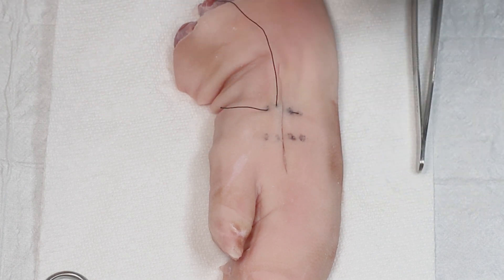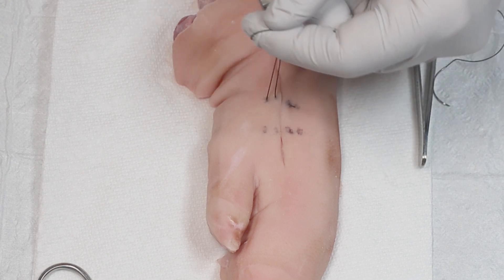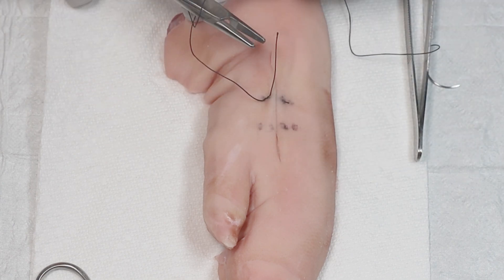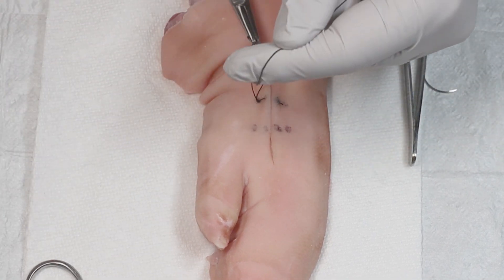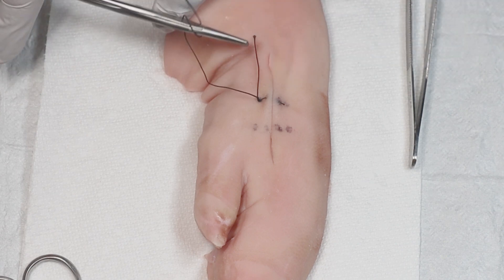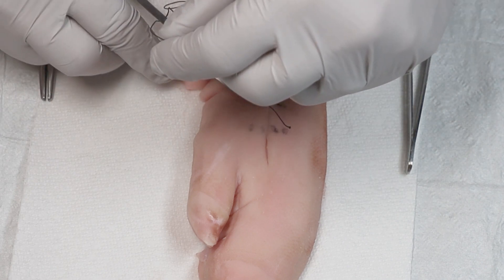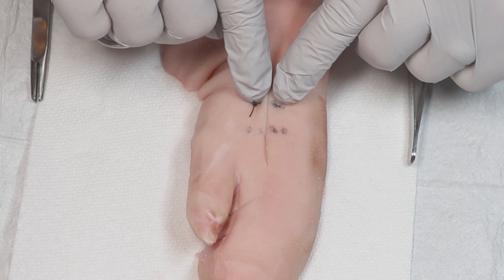You have a short end and a long end, which has the needle on it. You're going to do two loops — one and two. Grab the end of the short end and cross over. That'll give you a nice surgeon's knot and a nice flat knot, and it everts the skin very nicely. Then you'll do a few single loops. And maybe one more. Now we're going to cut about a quarter of an inch. There you have a vertical mattress suture, and it really did a nice job of everting those wound edges, and that will heal very nicely.